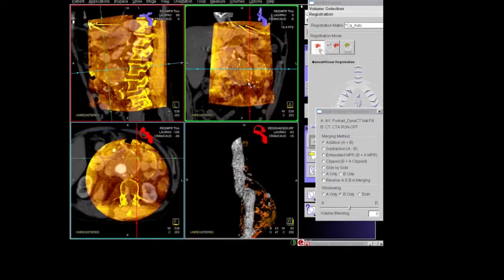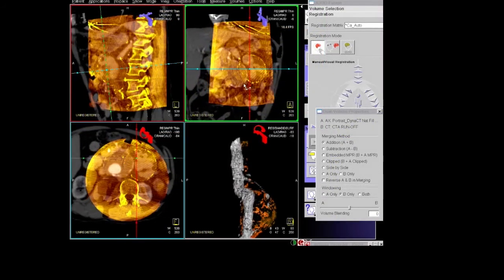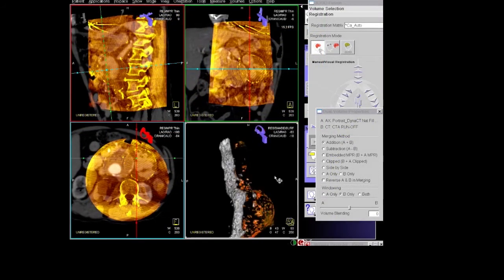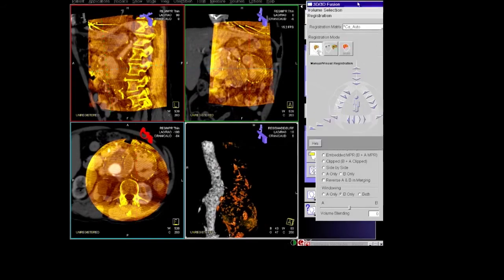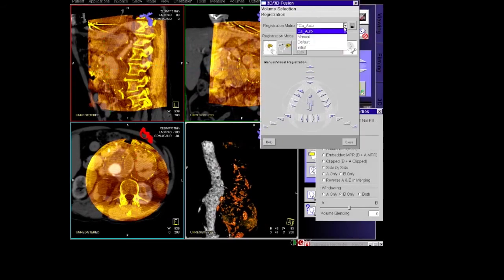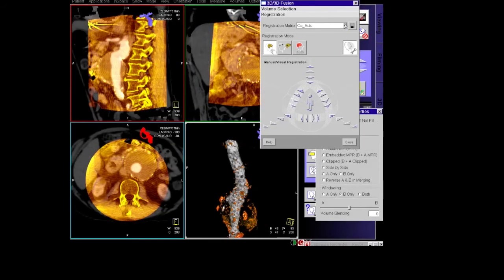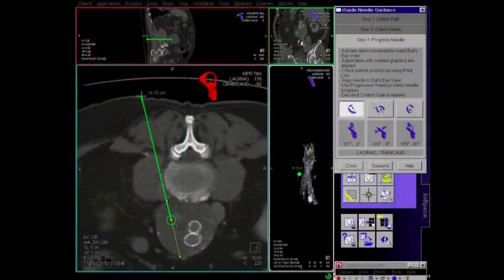Once these two images have been fused together, we can switch to planning mode. We've also started using the wall calcification of a blood vessel to increase the accuracy of this. In the workstation we then place a circular marker on the target and an X on the entry point in the skin, and this needle trajectory is then calculated.